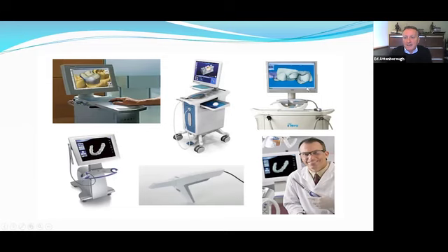Again, that has now gone open with a restorative workflow as well as the orthodontic workflow, so that you can upload STL data and that can be downloaded by your local lab or any production center such as ours to manufacture the restoration for the crown and bridge workflows. Here we can see the 3M scanner and also here the Trios scanner.